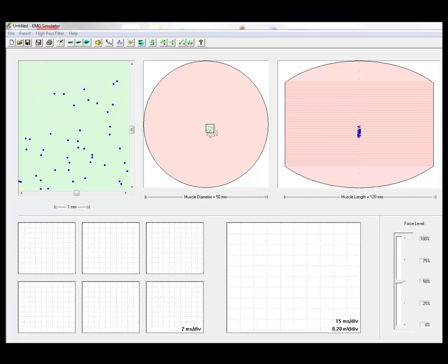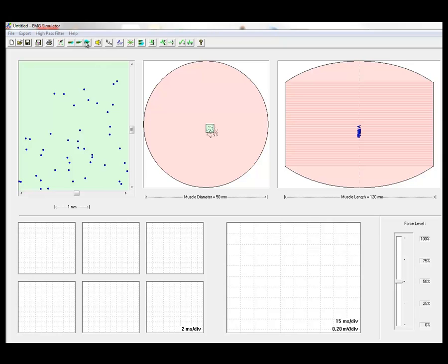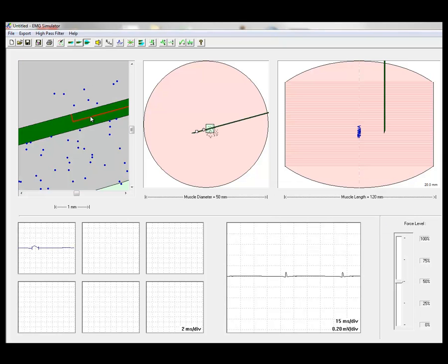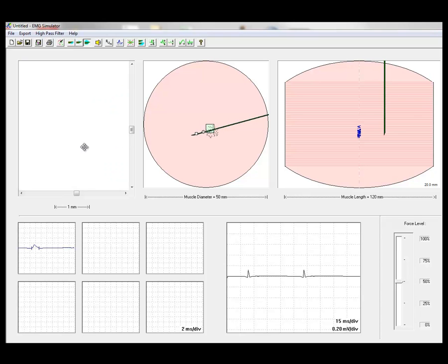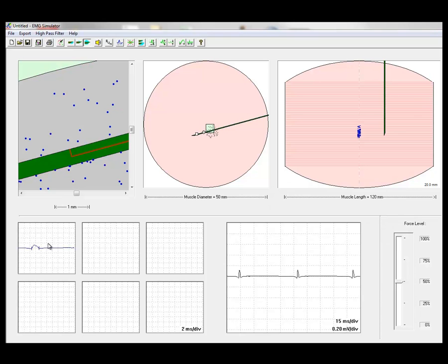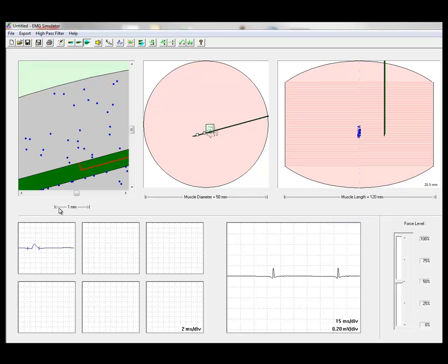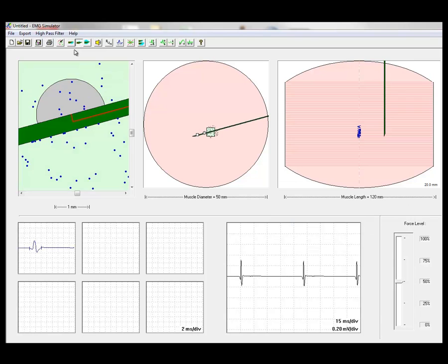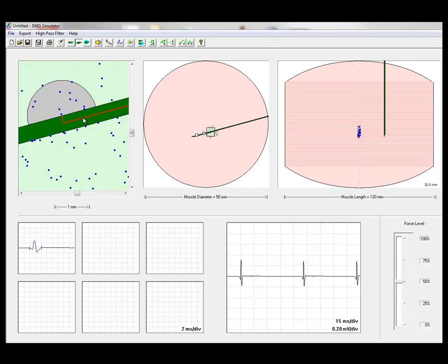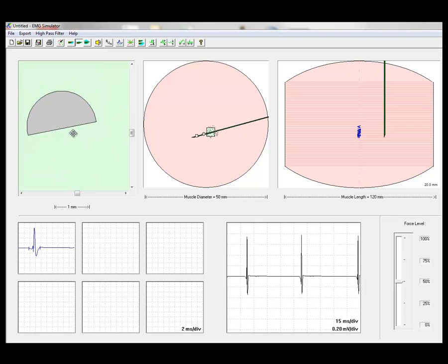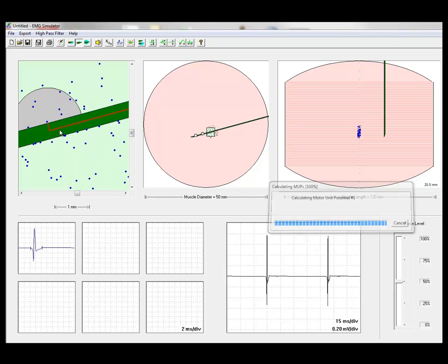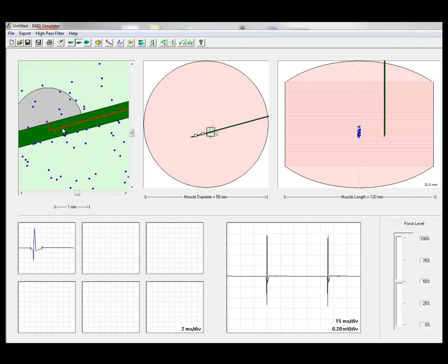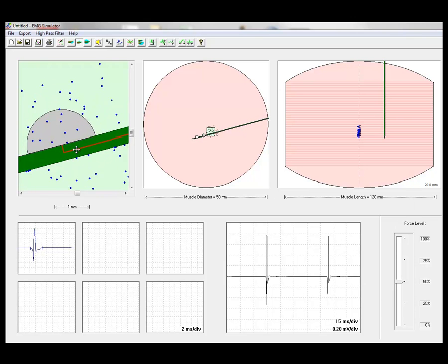We can also simulate macro EMG by inserting an electrode with a very large uptake area. You see that the response that we obtain is not very sensitive to the position of the electrode, typical of macro EMG. Or we can simulate single fiber EMG with a small uptake area where we get small spiky signals very sensitive to recording position.